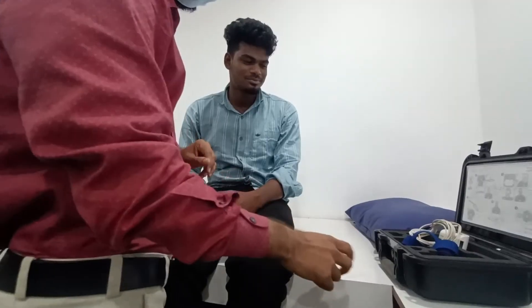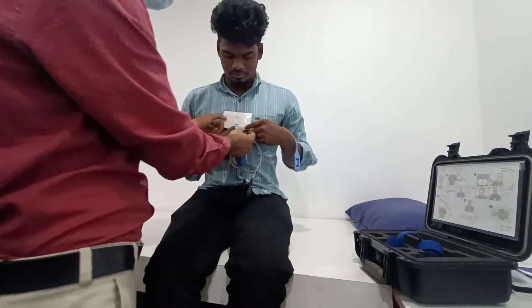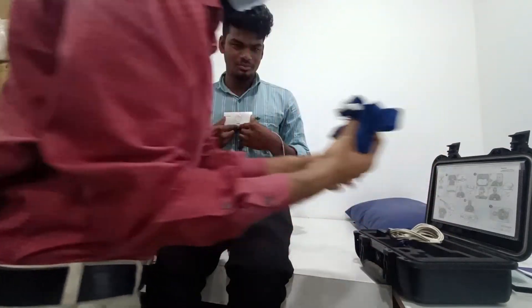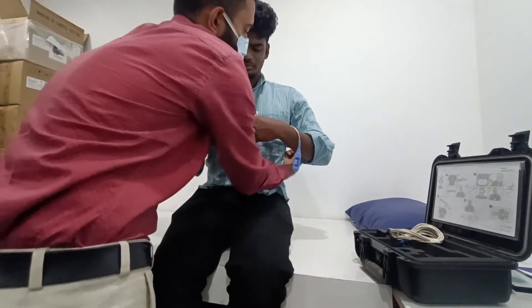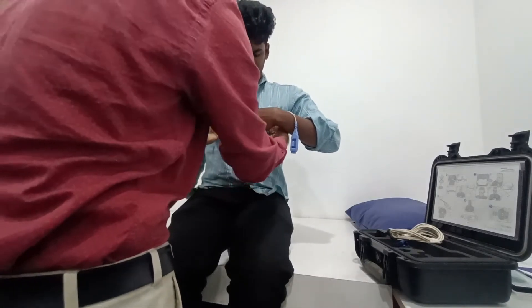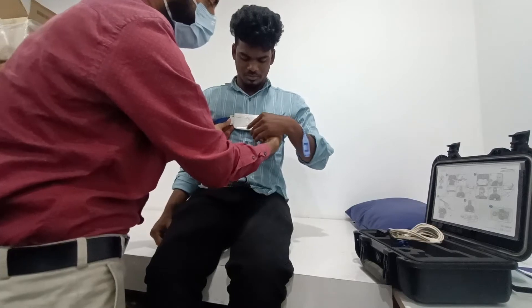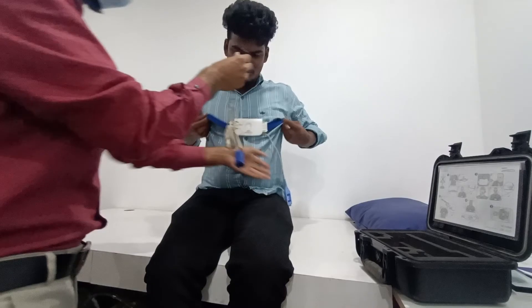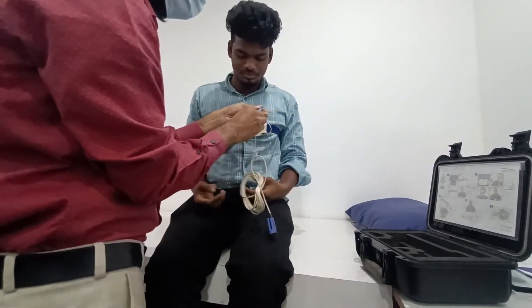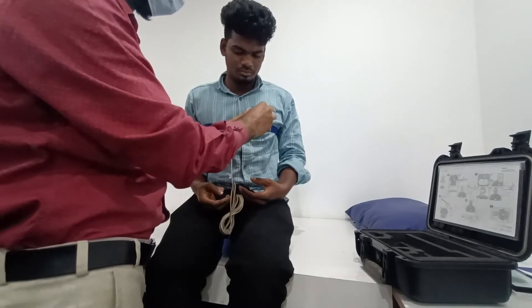We'll connect the device now. I'll ask the patient to hold the device like this — please hold it. We'll put the chest belt — just click it like this, you will get that sound. Make sure it is secured. After that, connect the oximeter; you will have a clip like this to secure the oximeter on the belt.